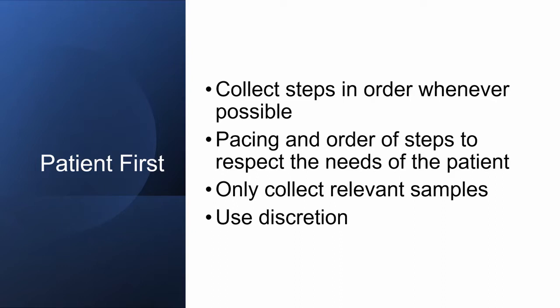As we see in this case scenario, the patient is unable to recall many of the events, and as such, the answer to many of these questions is unknown. This means that several items of evidence will be collected by default. Collect the steps in order whenever possible. The pacing and order of steps may need to be adjusted in order to respect the needs of the patient. Only collect relevant samples and use discretion.